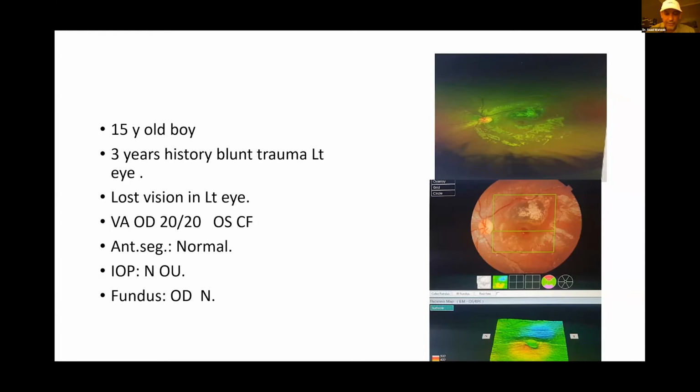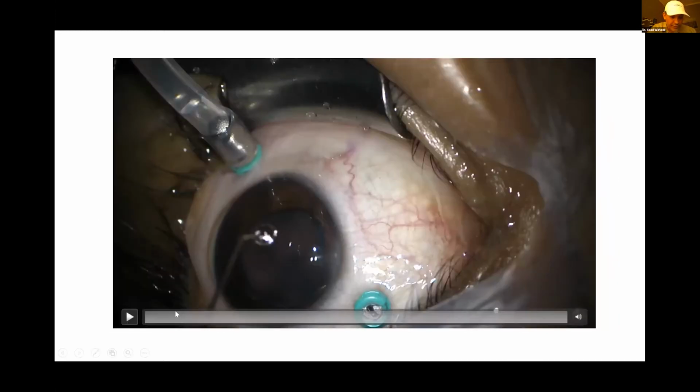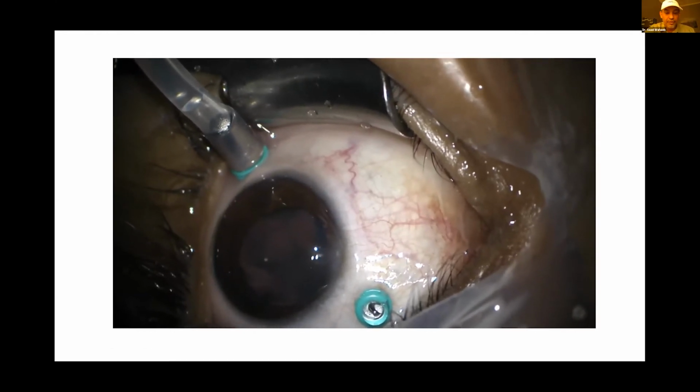The rest of his examination was normal. And I sat with the patient, who did an OCT that shows quite a large macular hole with a basal diameter of 1,200 and an apical diameter of almost 800. I did discuss with him the possibilities of multiple surgeries, and we agreed, and we went on for his vitrectomy. And this was a 25 gauge 10K beveled vitrectomy.